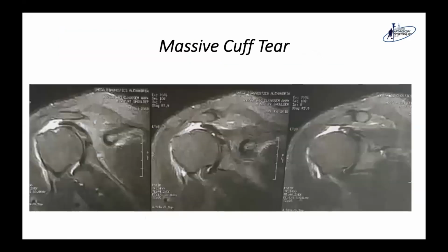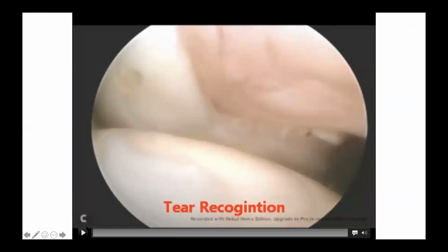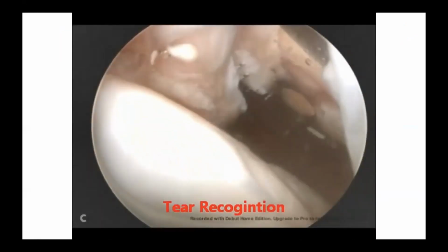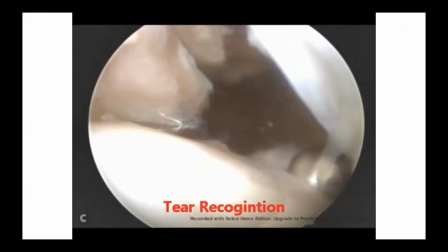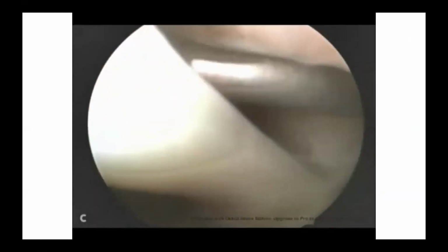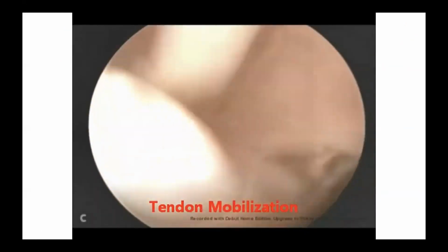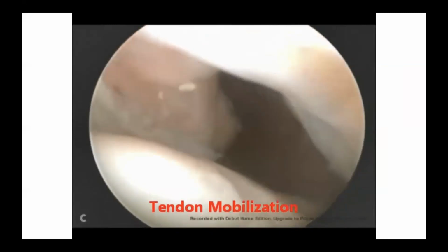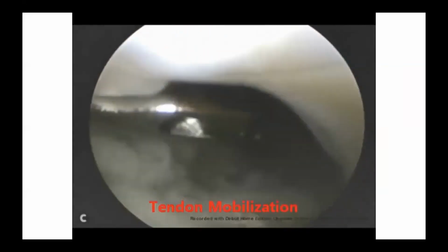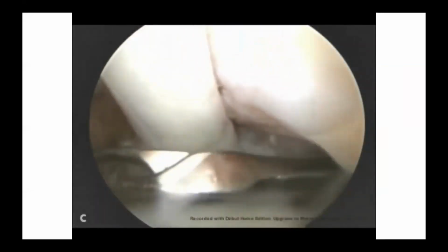This is a case of massive cuff tear, and this is the video of one of the cases. We started with recognition of the tear from the articular side. This is a right shoulder. We operate in a semi-sitting position. We start by mobilization of the torn retracted tendon and checking the reducibility of the cuff after doing the mobilization.